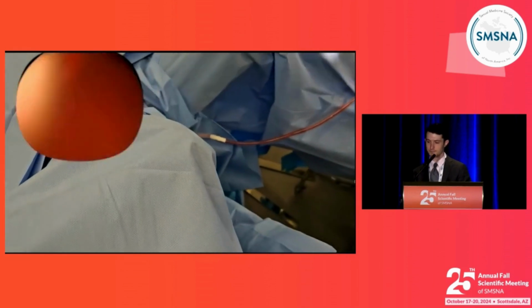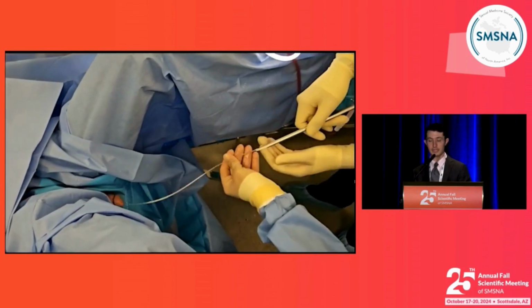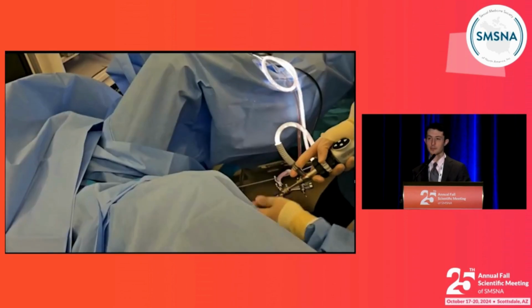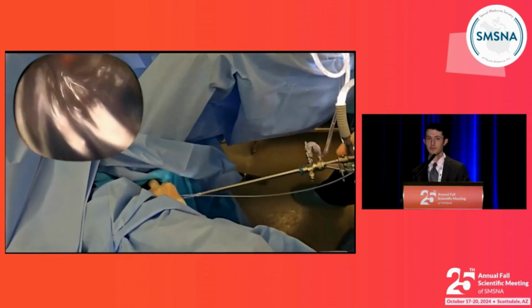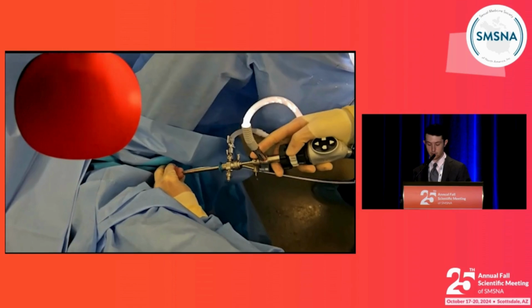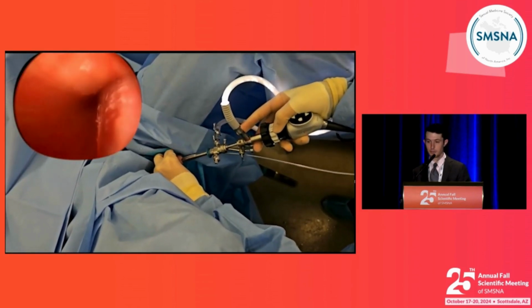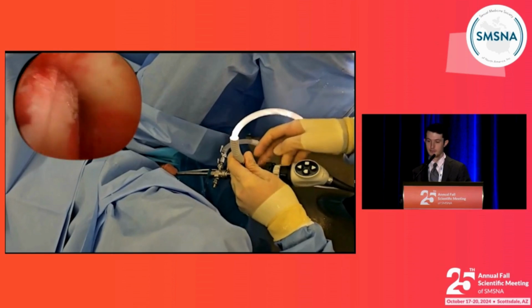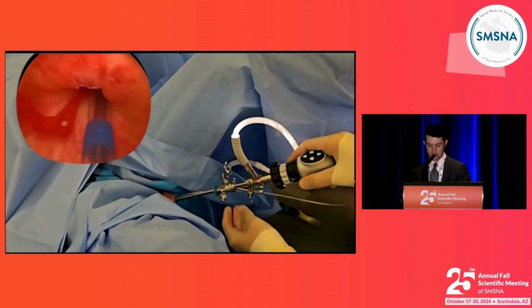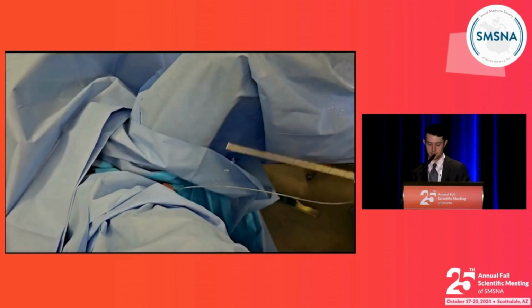the drug-coated balloon. Prior to the insertion of the drug-coated balloon, care should be taken to avoid submerging the balloon into irrigation fluid or aggressively rubbing the catheter as a way to avoid removing the paclitaxel coating. Again, the cystoscope is advanced to confirm the positioning of the drug-coated balloon, with the blue marker again ideally sitting at the level of the external urinary sphincter. In this case, the drug-coated balloon should be allowed to rehydrate for about 1 minute prior to inflation.